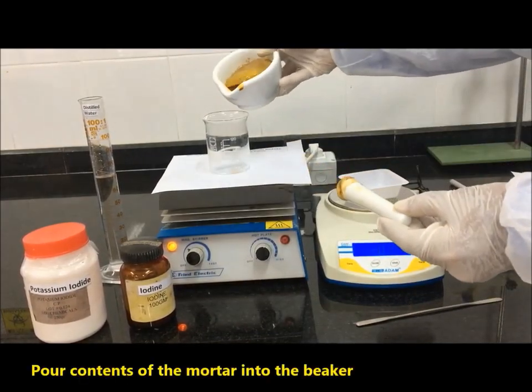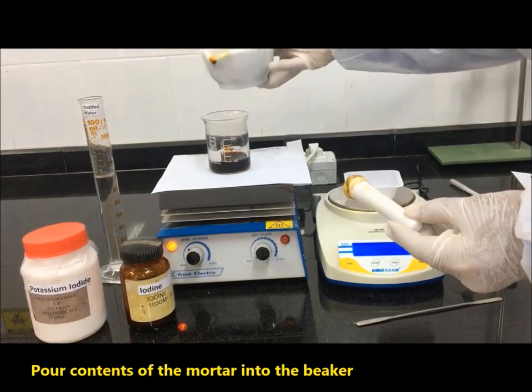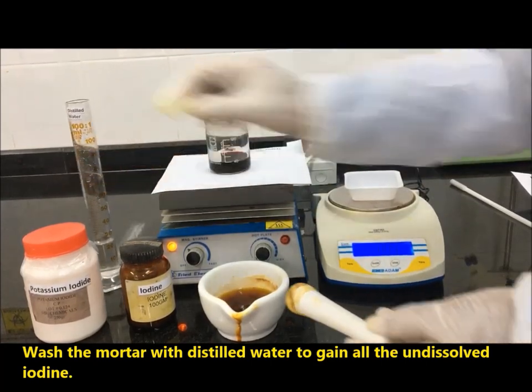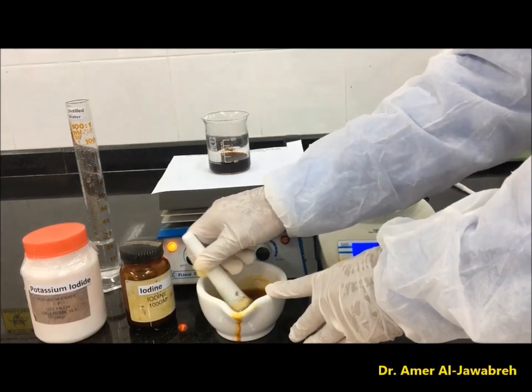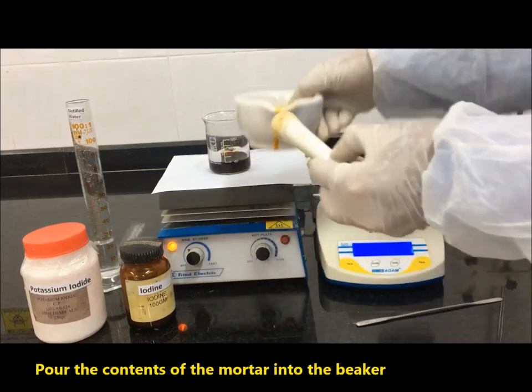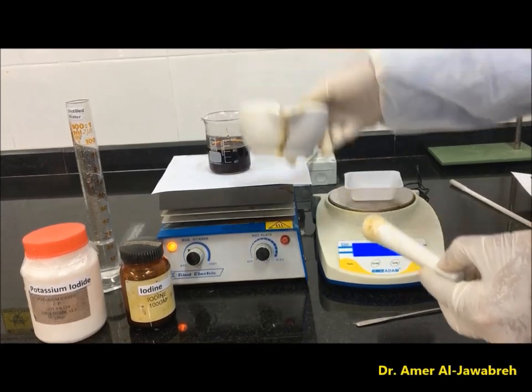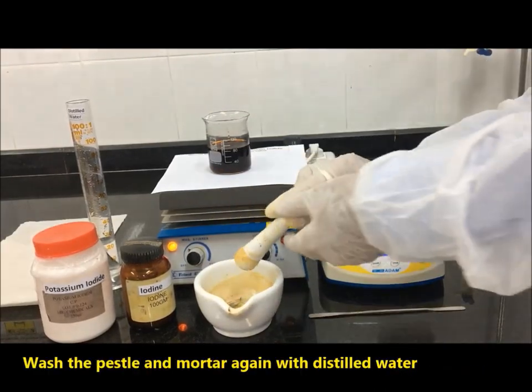Pour contents of the mortar into the beaker. Wash the mortar with distilled water to recover all the dissolved iodine, then pour the contents of the mortar into the beaker again. Wash the pestle and mortar again with distilled water.